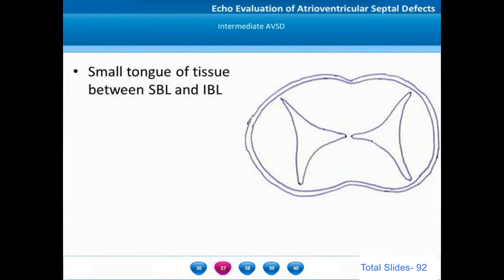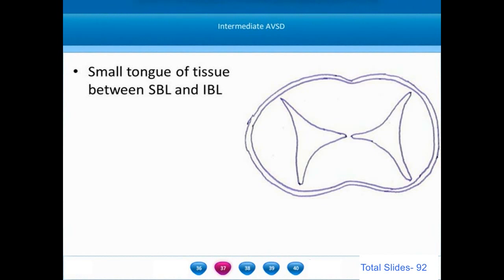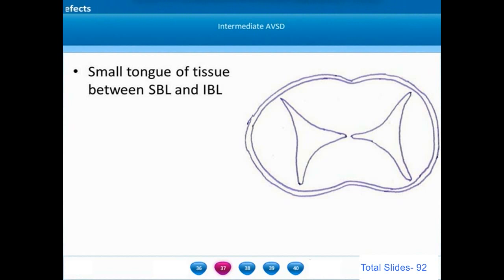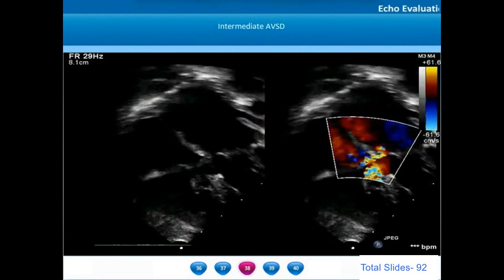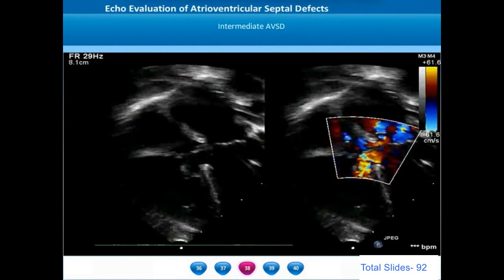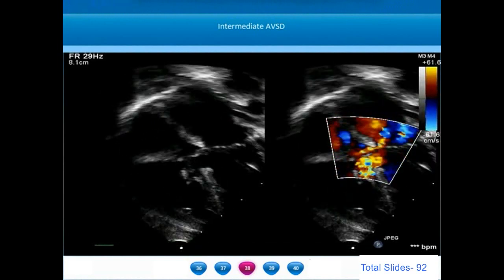In a complete AV septal defect the superior and inferior bridging leaflets are well separated. In intermediate AV septal defects, even though the AV valve annulus is common, there is a small tongue of tissue connecting the superior and inferior bridging leaflets. Intermediate and transitional types are relatively rare. This is an apical four-chamber view of an intermediate type showing a moderate-sized primum atrial septal defect and a moderate-sized inlet VSD shown with color flow, with small jets of AV valve regurgitation.